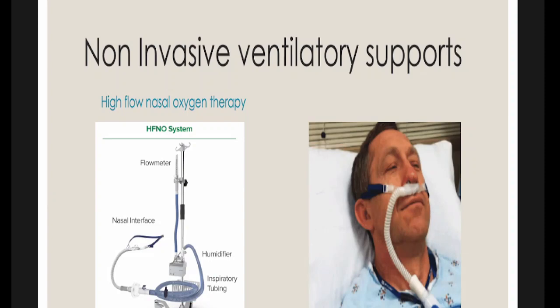By looking at this picture, M15096, could you please tell me, looking at this patient, this is a non-invasive ventilator support, but in your opinion, what are the risks associated with this mode of ventilation? Madam, we cannot supply an adequate amount of oxygen through non-invasive methods. Here in this one, we can supply fraction of inspired oxygen, but apart from that, what are the other problems that you will see in this setup?